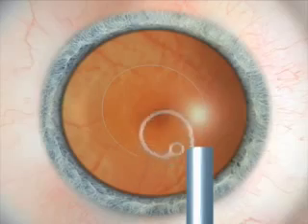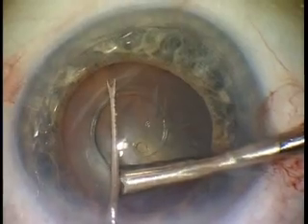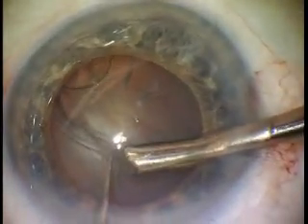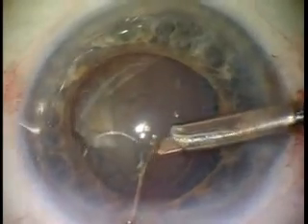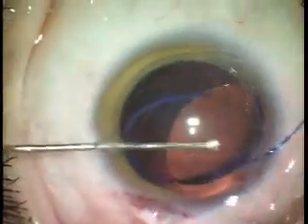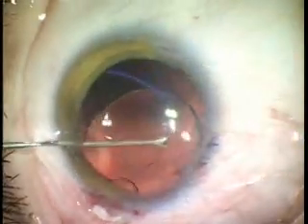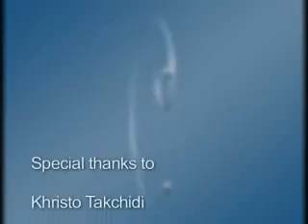The Malugin-modified Cionni CTR is the new capsular expansion device designed to be injected through a microincision and to center the subluxated capsule by securing it to the scleral wall. We have shown that the modified CTR allows loose eccentric capsules to be re-centered and secured, achieving safe endocapsular implantation and long-term stability of the capsular bag. Thank you for your attention.